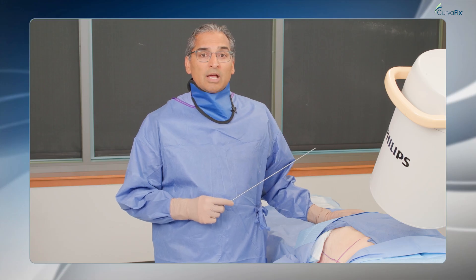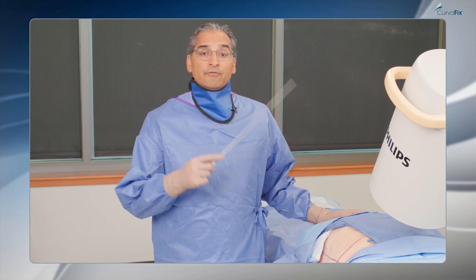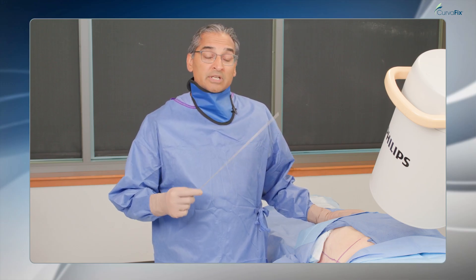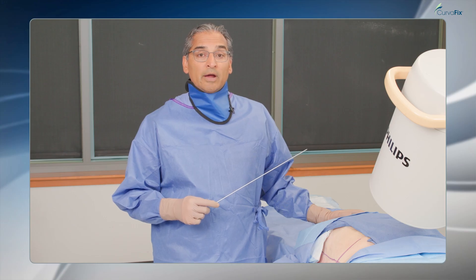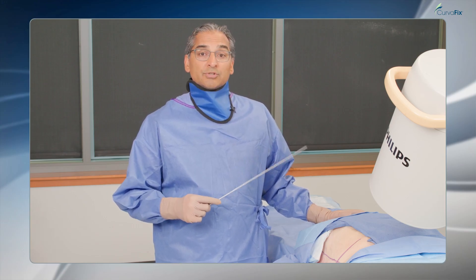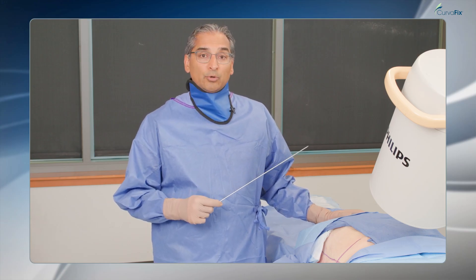One of the features we'll be utilizing here is the drill tip wire to get through the far side of the cortical bone. This is particularly important in patients who have good quality bone or a high energy pelvic ring where the bone quality does not allow for simply using the ball tip guide wire and malleting it across. In this scenario, we'll use the drill tip so that we can drill a hole and then put our ball tip back in to help navigate through hard bone.